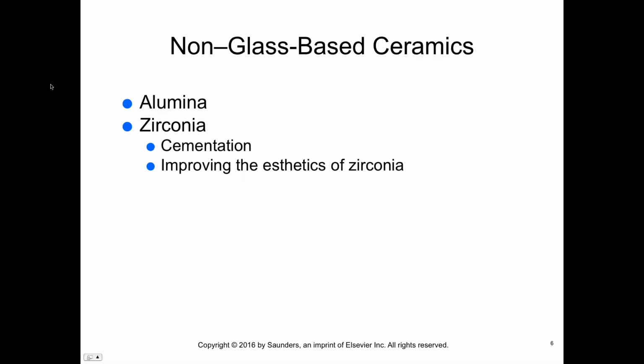It has a crystalline matrix composed of alumina and an alumina magnesia or alumina zirconia mixture called a spinel. Zirconia ceramics are the strongest ceramic materials currently used in dentistry. They have the highest flexural strength and fracture toughness, at least twice as strong as the alumina-based ceramics. They can be heat processed or machined. They can be used in the anterior and posterior for crowns or as cores for 3-unit bridges.